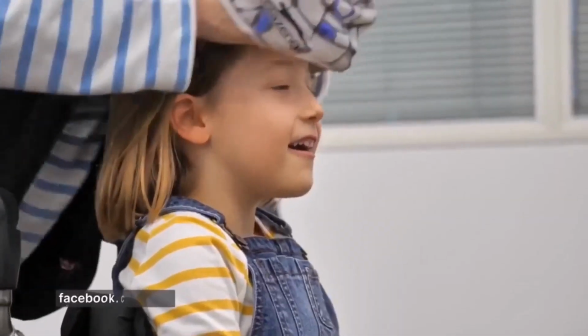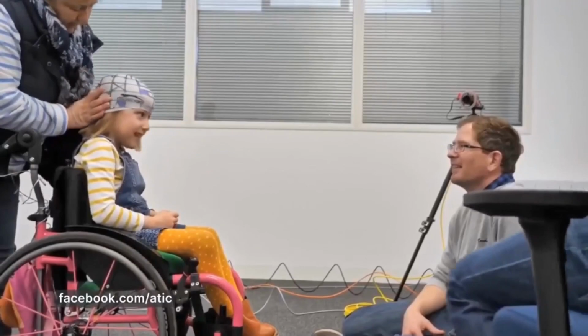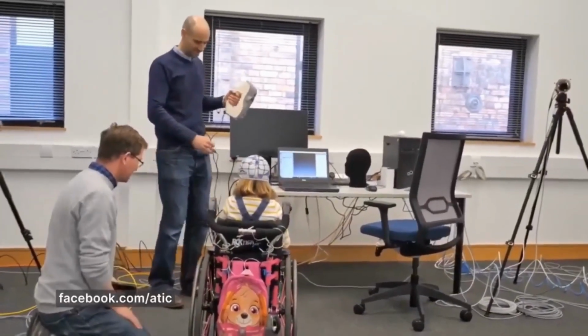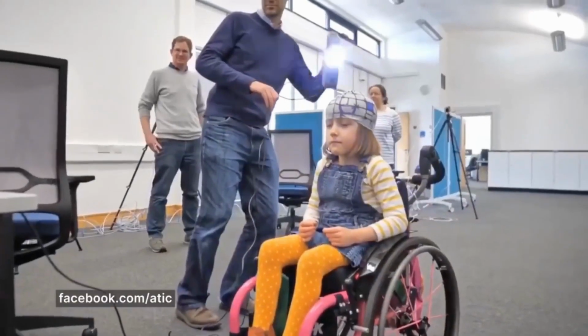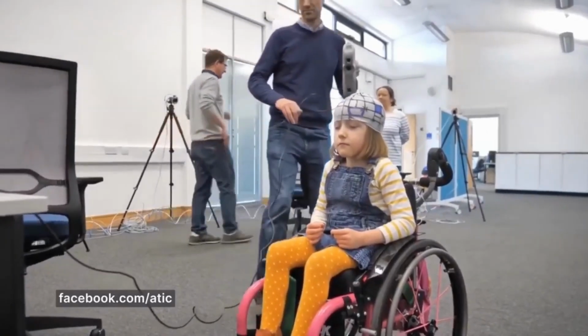Artec 3D scanners were also used to help make comfortable and safe helmets for children with various conditions. Imogen, who is diagnosed with spastic diplegia, can't walk but loves riding a horse. But because she was also born with hydrocephaly, excessive swelling of the brain, her head is wider than normal, which means she could never find the riding helmet that fits correctly.